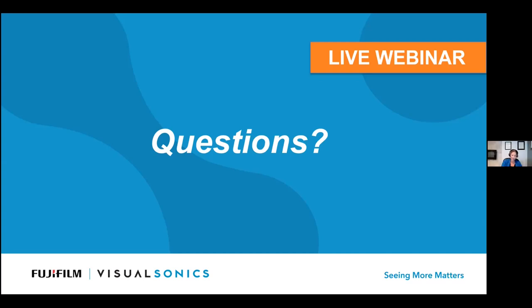Great, thank you. The next question: how does bone or fat interfere with photoacoustic signals or imaging? For bone, we had the possibility to image through the skull. We tried at the beginning with the skull and without the skull. Of course, we have better resolution without the skull, but it's so easy to do without any surgery, without needing to remove any skin or skull. You can increase the gain, and you get nice images of the brain. So it's working quite well for the brain.